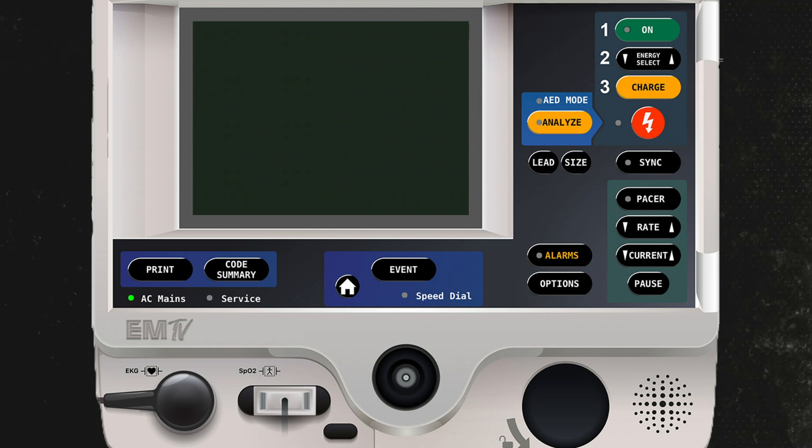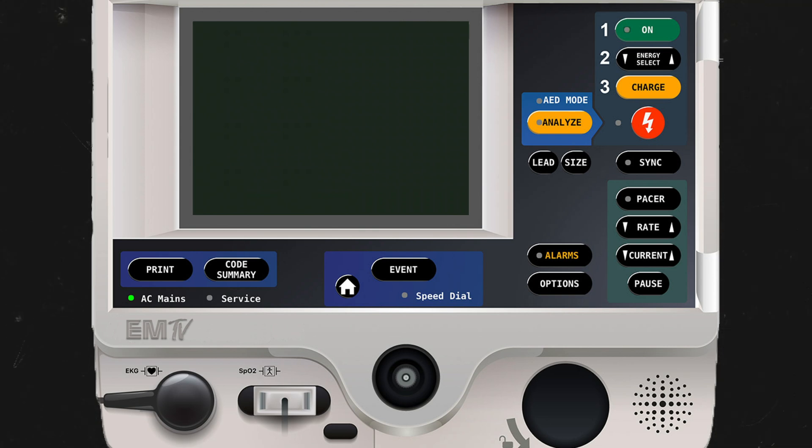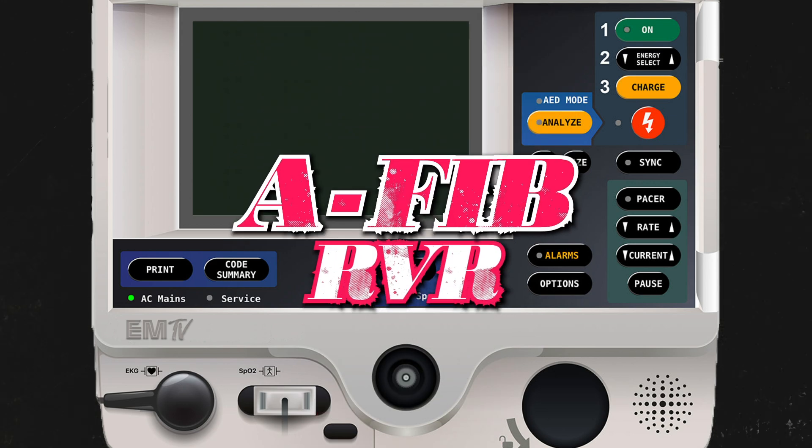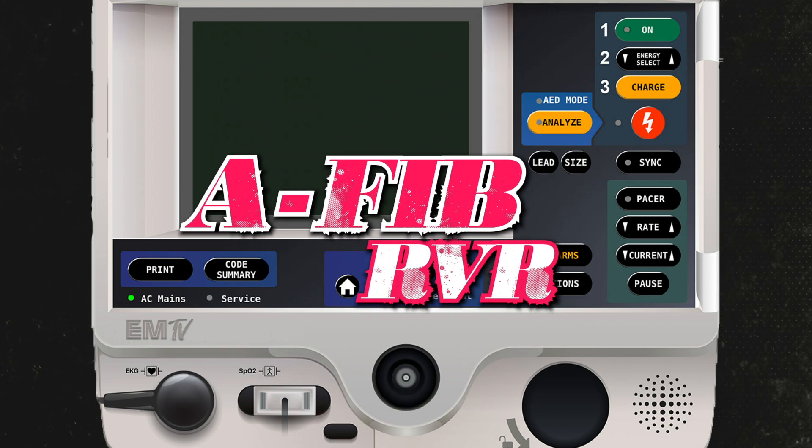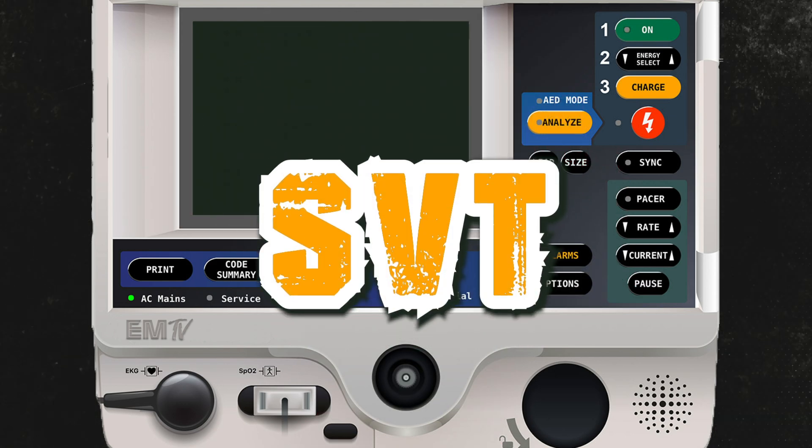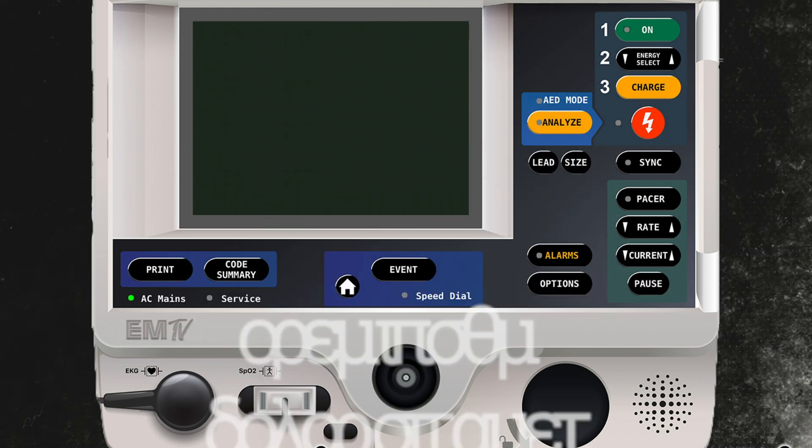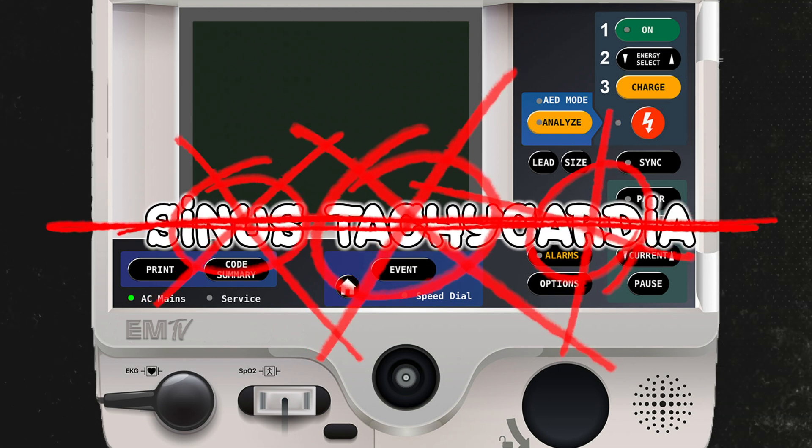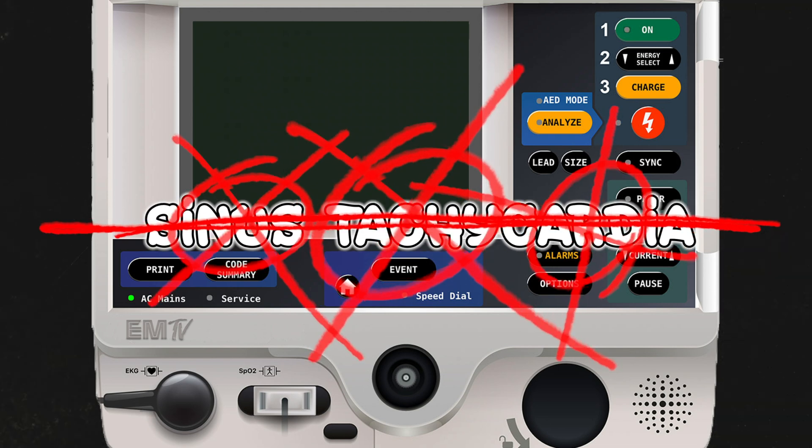Unlike defibrillation, synchronized cardioversion is delivered to people who are in unstable tachycardic rhythms, such as AFib RVR, VTAC with a pulse, and SVT. Synchronized cardioversion should not be used to correct sinus tachycardia.